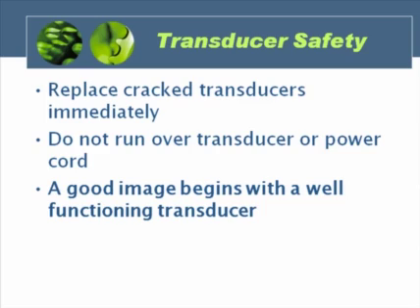Transducers that are damaged with frayed wires or cracked housings need to be replaced immediately. It's very important to mind the cables and the power cord to be sure that you don't run over them with the machine. Remember that a good image begins with a well-functioning transducer.